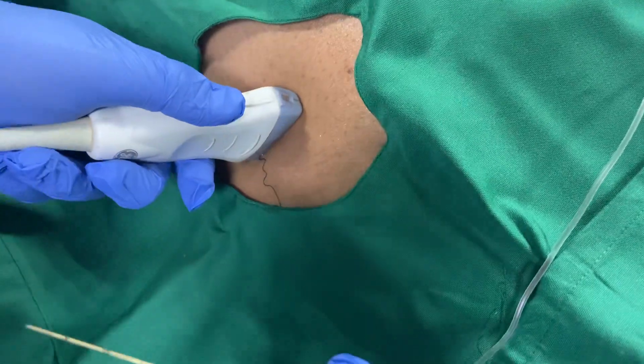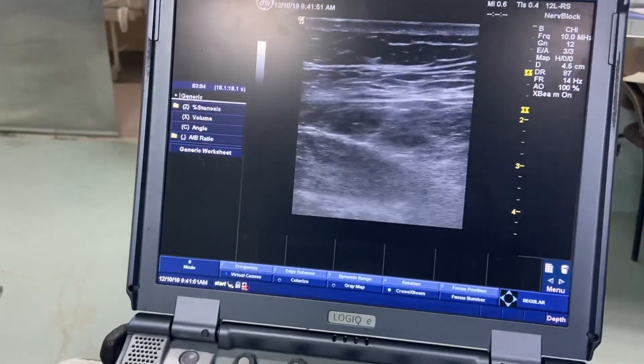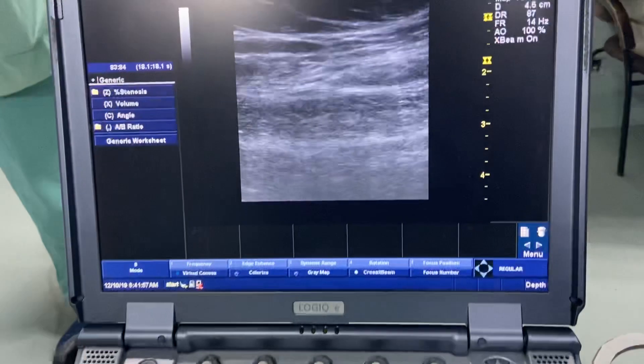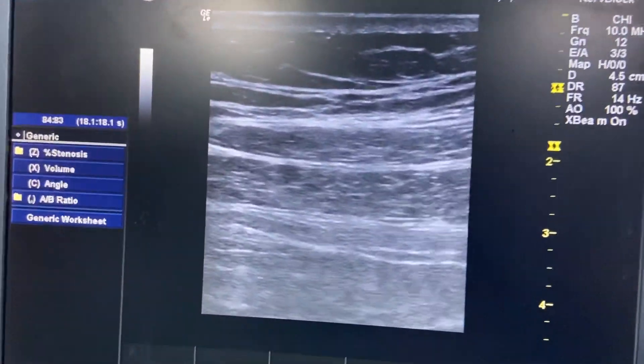This is a quite obese patient. When we put the probe here, you can see nothing. But when we apply pressure — Dr. Nikunj is applying pressure — you can see the muscle layers. You have to apply lots of pressure to visualise the muscle layers.